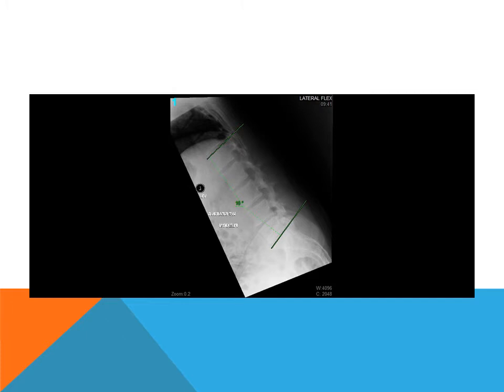So we've lost 50 degrees of lumbar lordosis in moving from neutral lateral to full flexion. That loss of 50 degrees is distributed among each of the individual motion segments. So now when we measure each of the intersegmental angles and compare the changes from the neutral lateral, those changes should all equal 50 degrees of change.